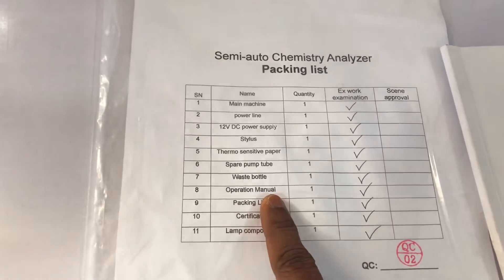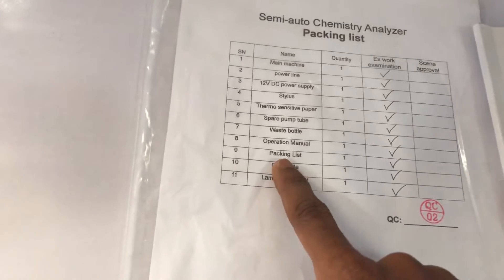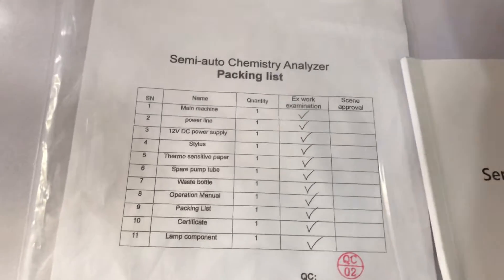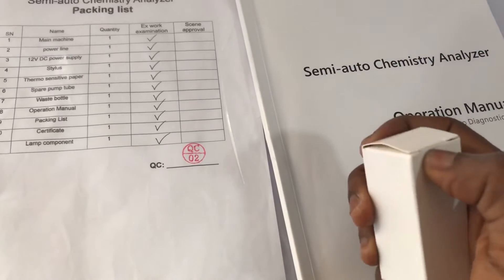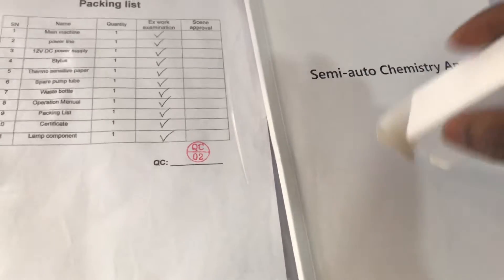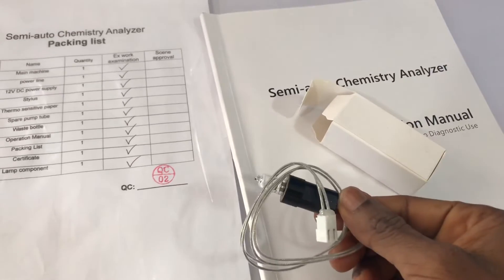You also have your operational manual, a packing list, and your certificate — which just confirms that everything is in order. Then you have an extra lamp. In case the lamp inside the machine gets burned out, you can use this extra one. This is what it looks like — it's a lamp that you fix into the machine.